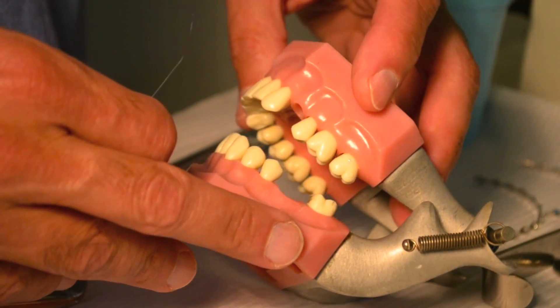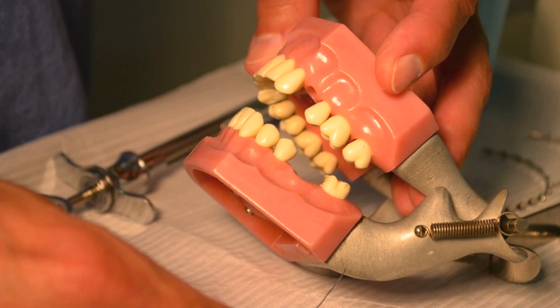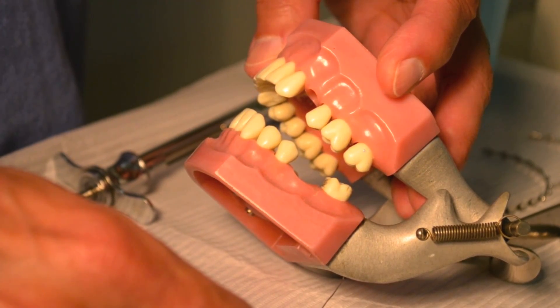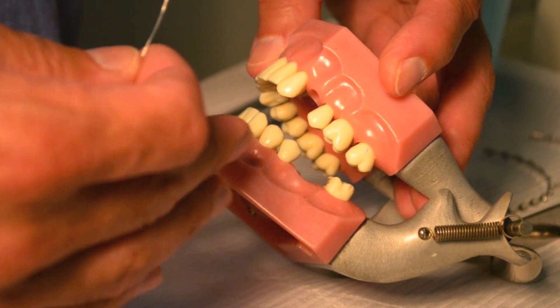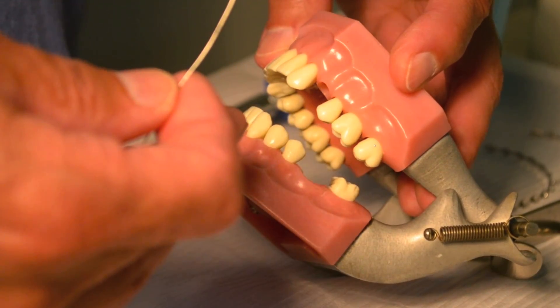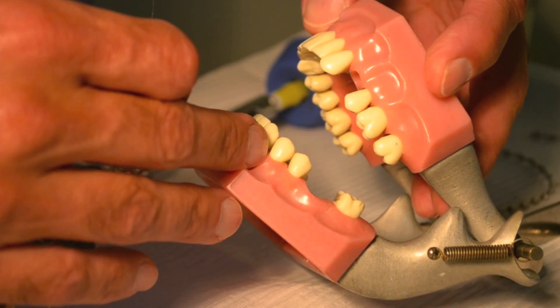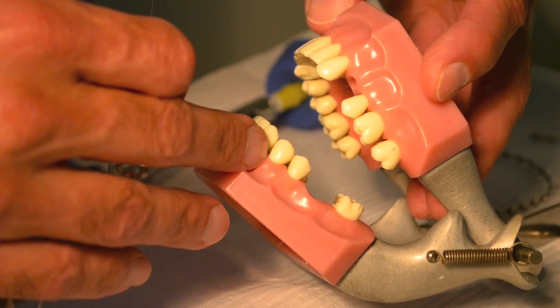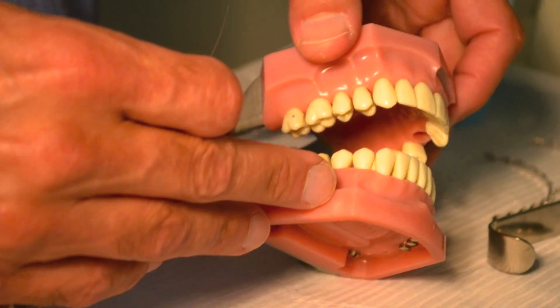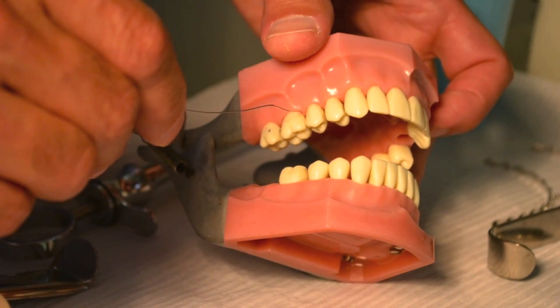Typically, I always begin with the maxilla because if the patient has a fractured mandible, it's going to be very uncomfortable to have their mandible manipulated during arch bar placement. So you're better off getting the maxilla out of the way and saving the more uncomfortable stage to the end. I'll find a posterior tooth that's easy to place a wire around — in this case, I'm going to use the maxillary second bicuspid, which looks like a nice, easy tooth.